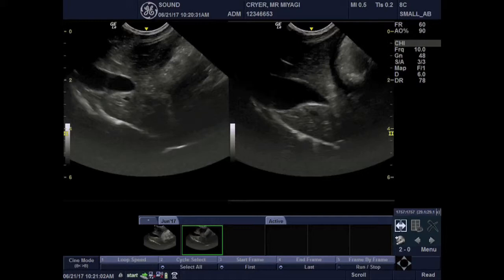In this example, you can see the image on the left had significant gallbladder sludge. You could compare the right image after the appropriate therapy to see if any sludge remains or if the treatment was appropriate.